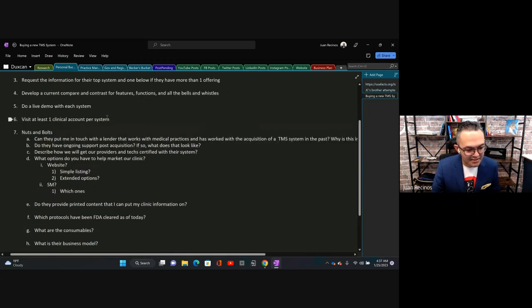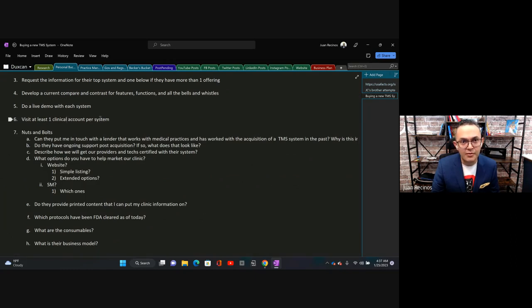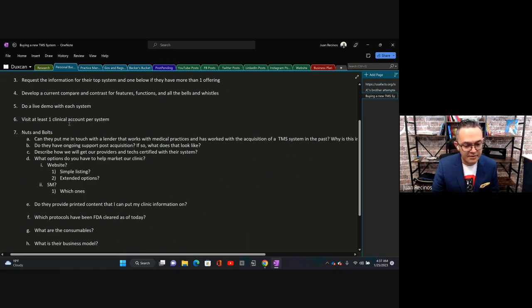All right, so visit at least one clinical account. So I did a live demo. I visited a clinical account, and clinical is very different. The word clinical means clinical. It means an outpatient setting, or it means a hospital system. I want to go into an operation and see it, as opposed to research. And a lot of people don't know that there's a difference between clinical and research, as it pertains to a center, and that's okay.